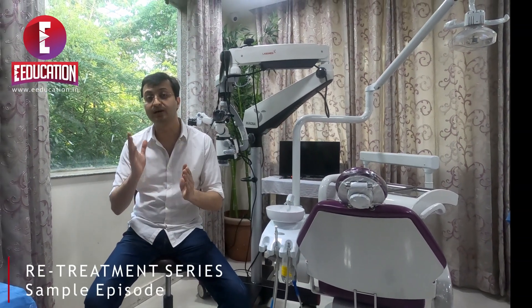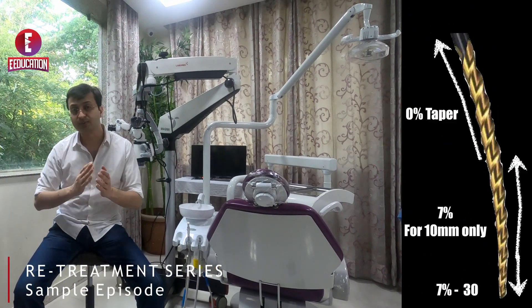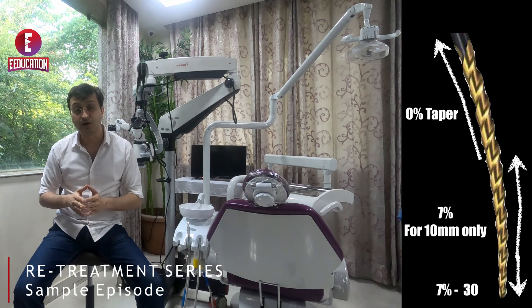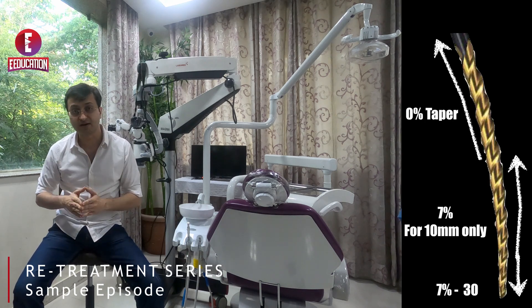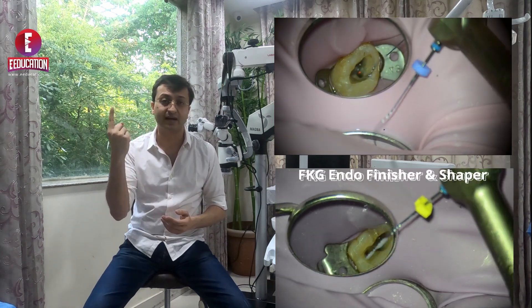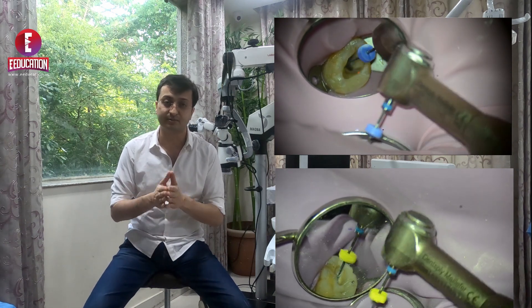You are talking about a file which has a 7% taper at a size 30 at its tip. But that 7% taper is only present for the first 10mm. Beyond that, there is a 0% taper, which means by the time you reach the cervical third — that most important pericervicular dentine — you will be preserving it as you insert this file. The fact that this is a 1mm wire makes it the thinnest or smallest retreatment file available right now, with the exception of files based upon a helical spring-like action.